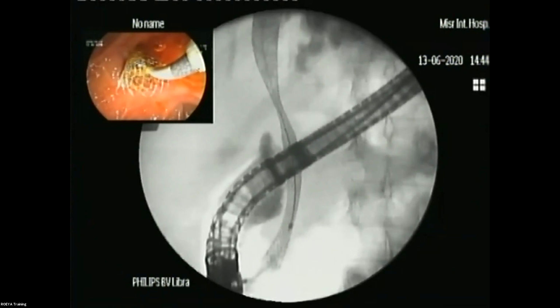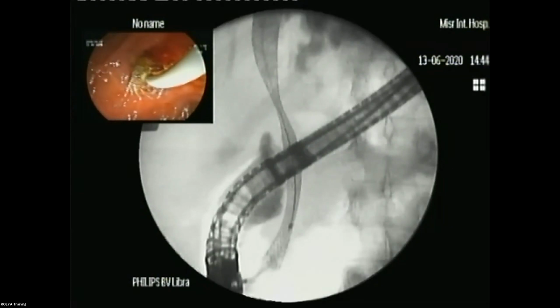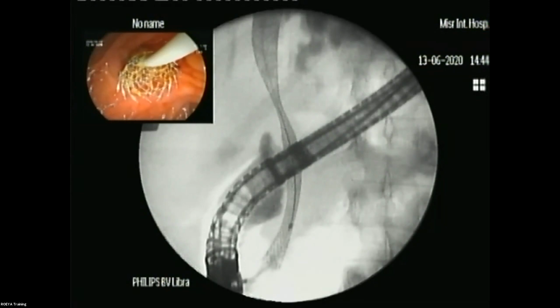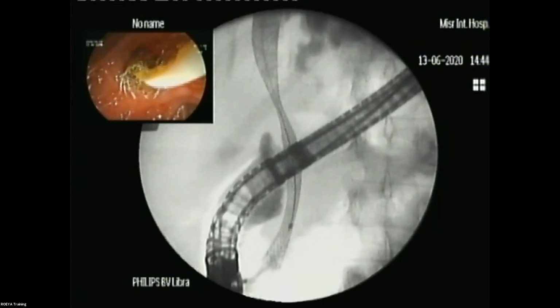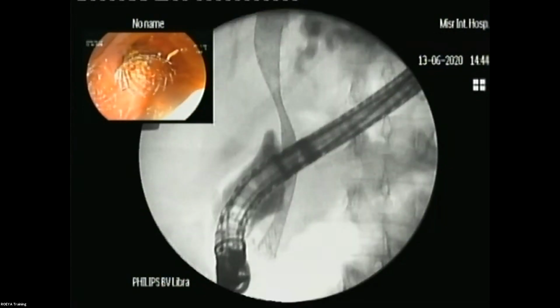This is what is called stent in stent. I will leave Hani to do this for 1 minute, and then we go to prepare the presentation. So you have 1 more minute to do this. Remember, Hani, that more than 200 doctors follow you. A lot of pressure.